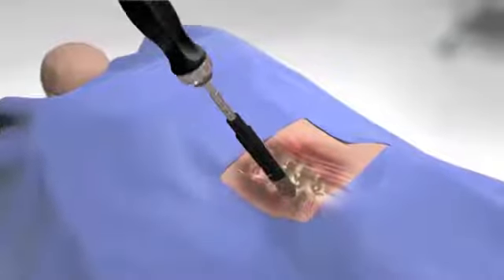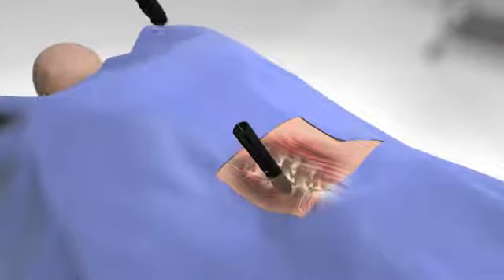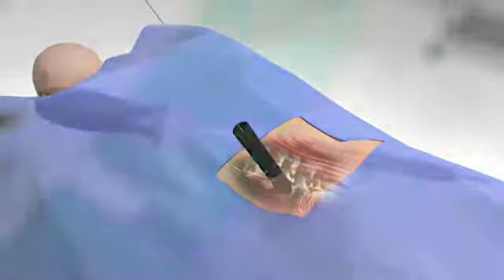Upon completion of tapping and screw length determination, remove the tap and dilator three while leaving dilator four in place.